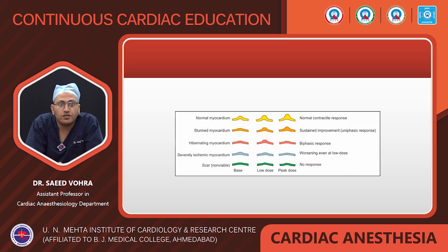In hibernating myocardium, at rest the contractility is reduced, it increases at a low dose of dobutamine, and it worsens again at a high dose of dobutamine, and it is a biphasic response. And it is a hallmark sign for myocardial viability. That is, the myocardium is still viable. It can be salvaged through revascularization.